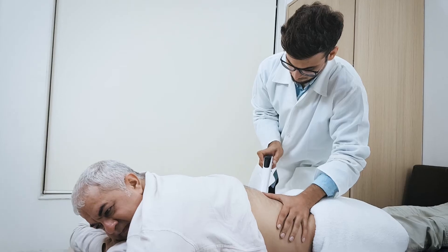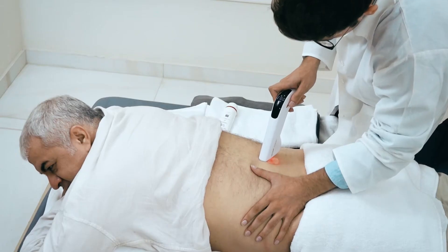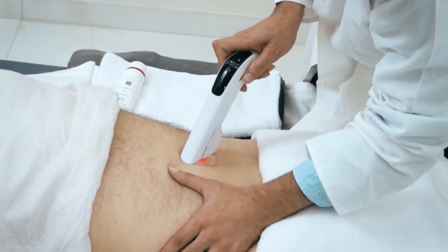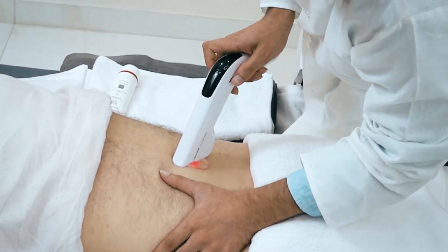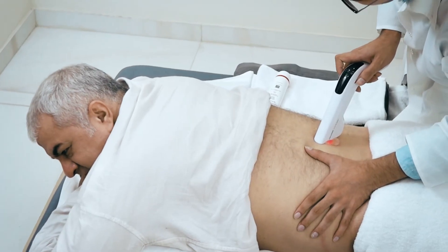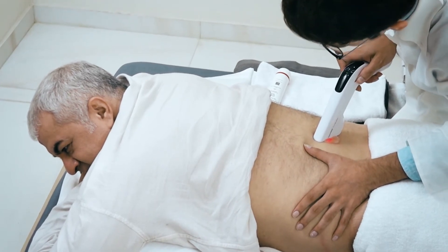Hold Cura Laser as demonstrated. Place the large therapeutic head in contact with the skin and slowly rotate the 360-degree wheel to activate the GT photonic cold laser and nanomolecular biostimulation. Increase the intensity of the biostimulation until the patient feels a needling or prickling sensation.